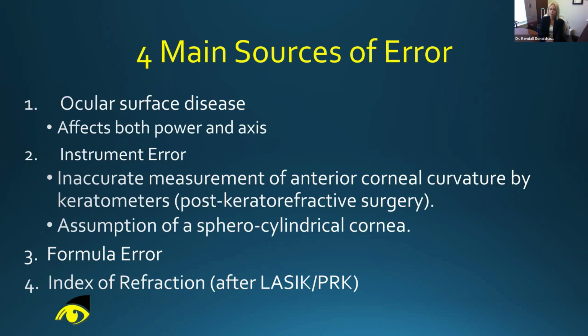We can have instrument error. A lot of our patients these days have had a history of RK, LASIK, PRK, and now we're doing their cataract surgery. We make some assumptions in all of these formulas, and they may be off because we've changed the shape of the cornea.